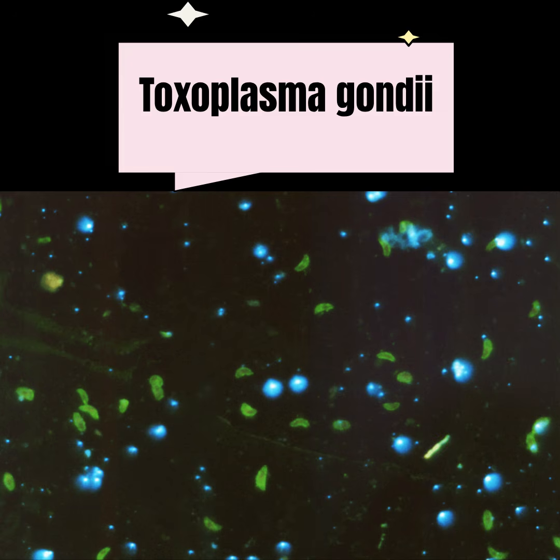The photomicrograph displays a definitive positive result for the indirect fluorescent antibody test utilized in the diagnosis of Toxoplasma gondii, which is an obligate intracellular parasitic protozoan of the phylum Apicomplexa. The underlying principle of the indirect fluorescent antibody test involves a two-step process, where patient serum or a known positive control is first incubated with fixed tachyzoites that are immobilized on a glass slide.